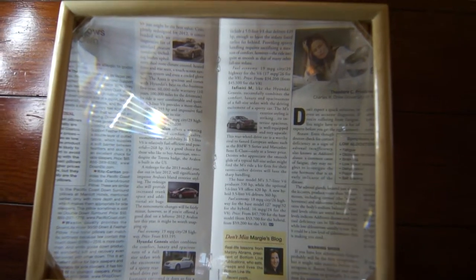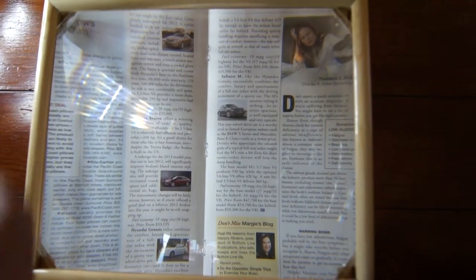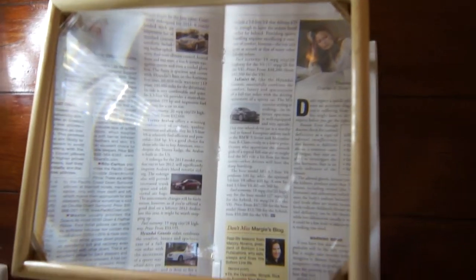Hi, this is another product from loopilyloops.com. This is a stand magnifier for our large 10 by 12 Fresnel lens, which is the best lens on the market. And what we've done is we've put it into a stand.